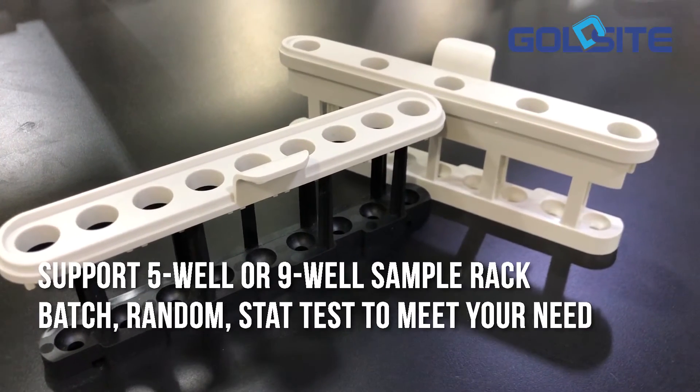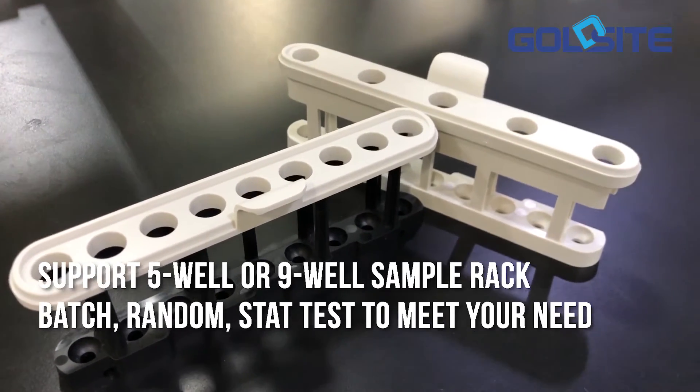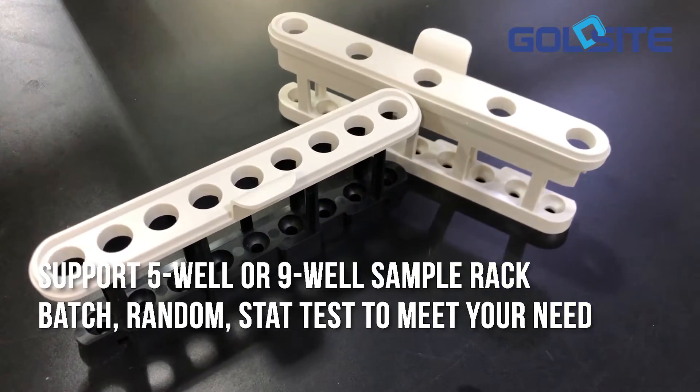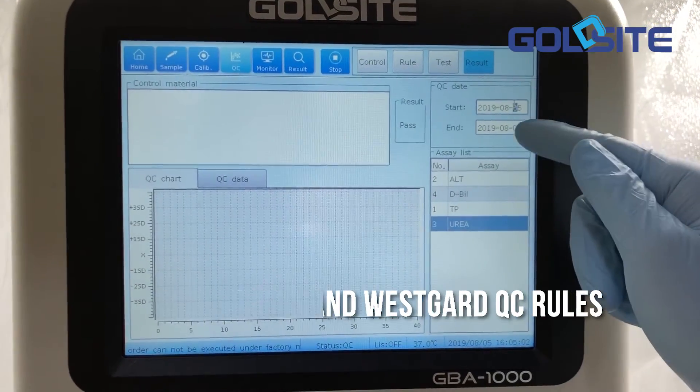Support 5-well or 9-well sample rack. Batch and random stat test to meet your needs. Supports Levy-Jennings charts and Westgard QC rules.